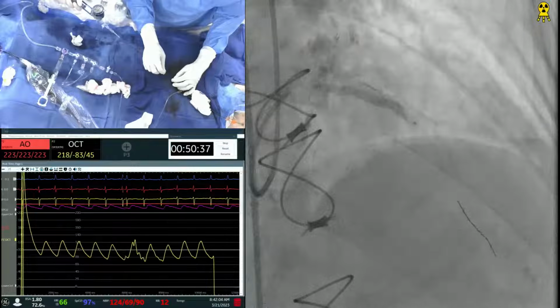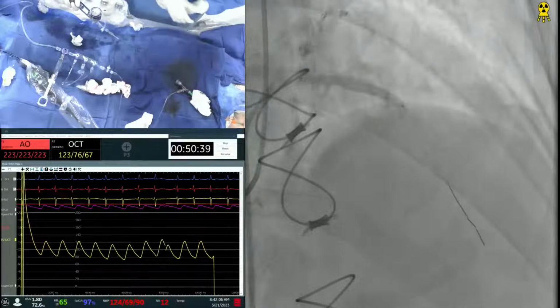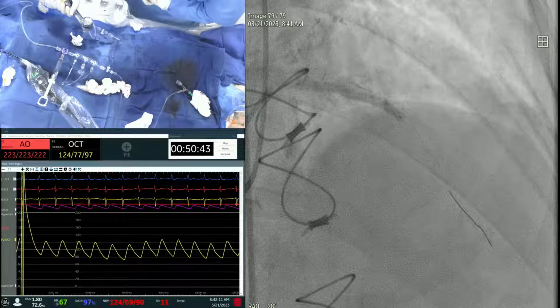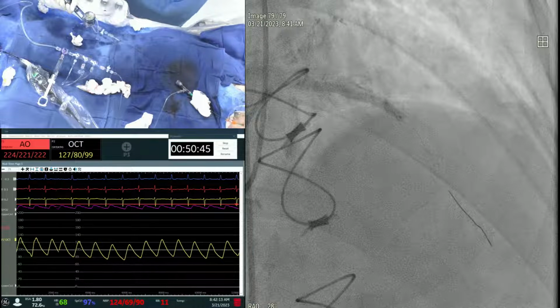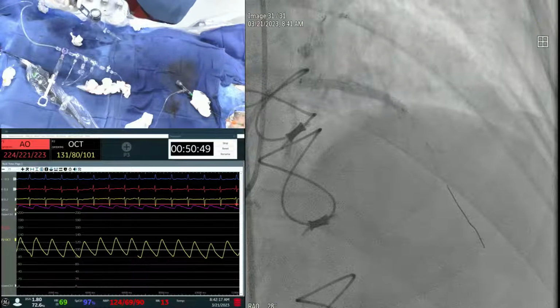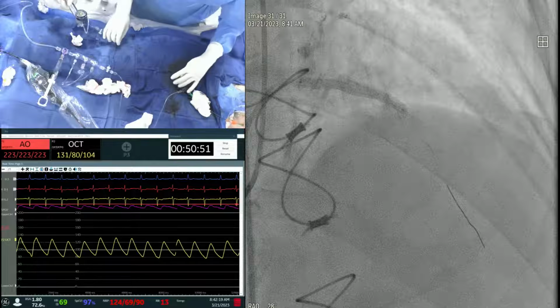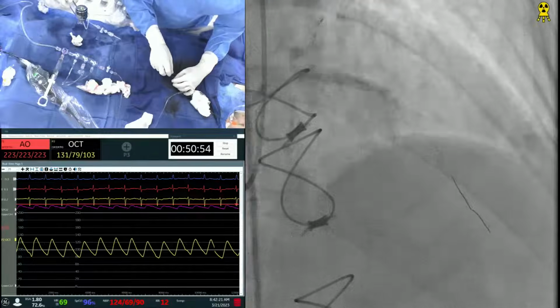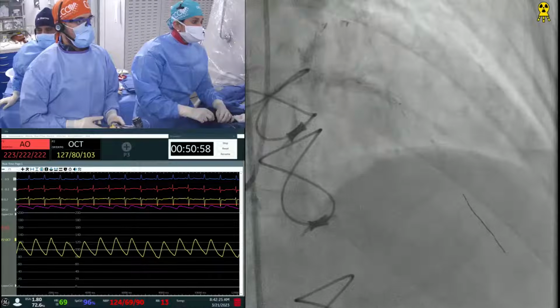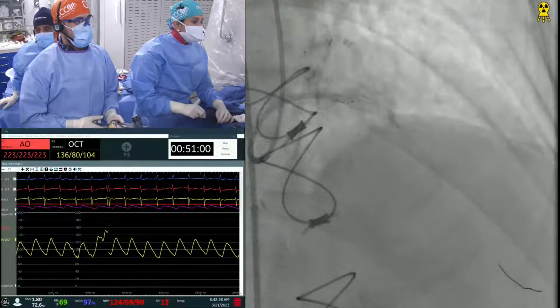He said 16. OCT ready? Yep. Down. Go up again. Here, in large vessels, if you have done plaque modification, then you put a stent, go to high pressure. I think that's okay. You don't need to go further. In a small vessel, less than 2.75 or so, and a long stent, you definitely should post-dilate. Always.